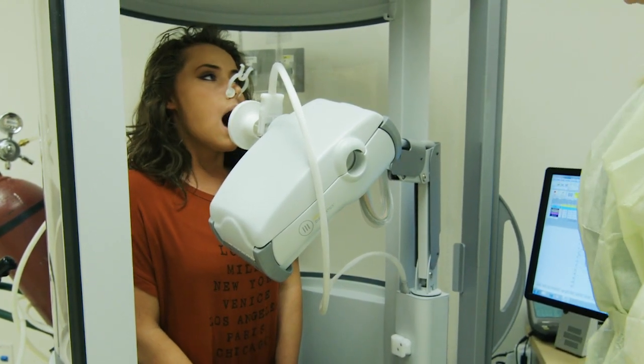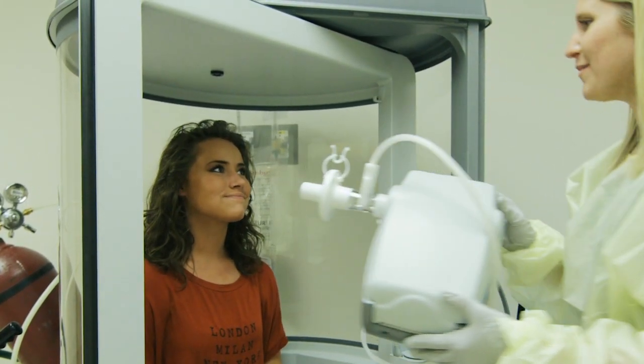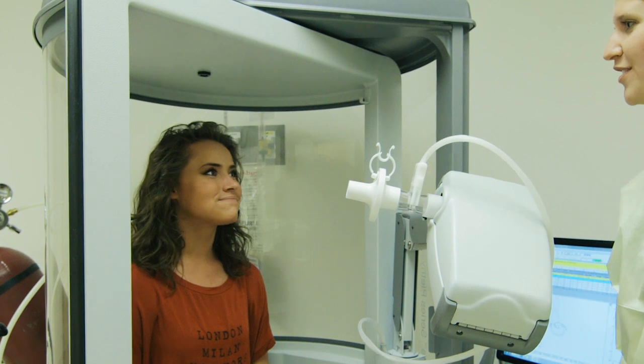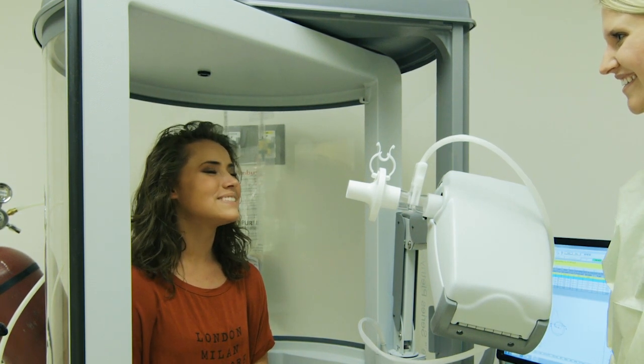Good! Now take a big breath in. Great job! You have just completed one effort. You will do this a few more times in order to complete the spirometry test.